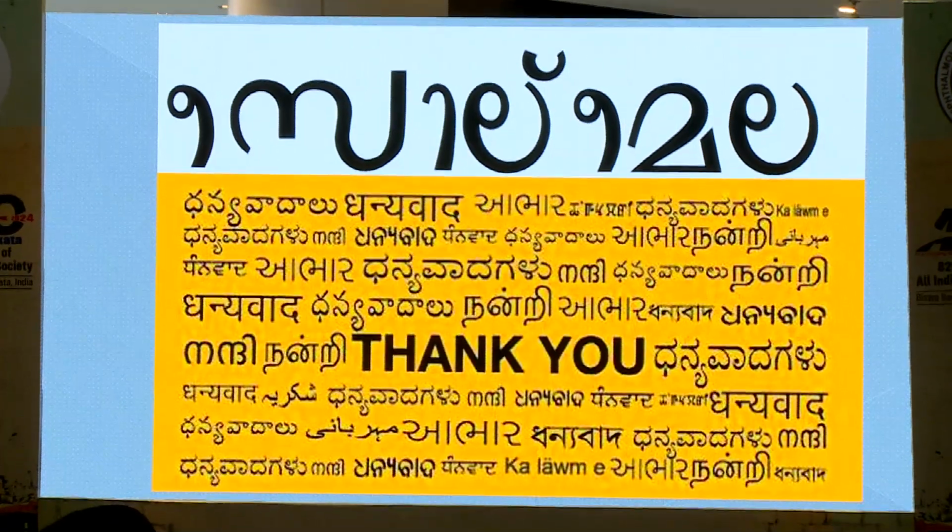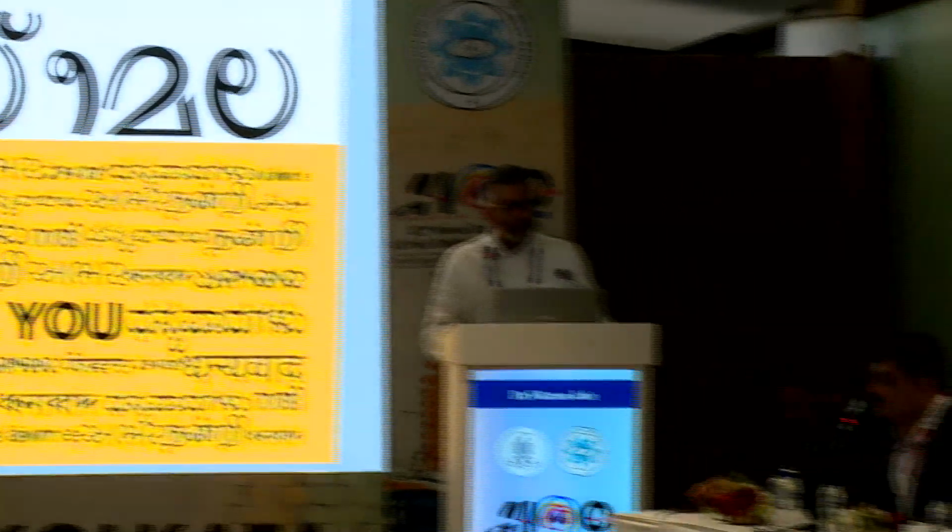Thank you, Dr. Vikram. I think most of us really were confused with the glare and halos with the dysphotopsia. So we tend to give them lubricating drops. We tend to give them, of course, we always wait for the neural adaptation to happen. In your case scenario, do you have any patients with the dysphotopsia? Did you really have a chance of explanting the lens? Not really. I have not explanted a lens for the dysphotopsia.